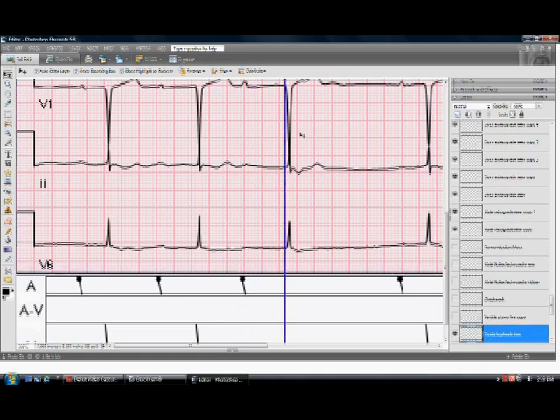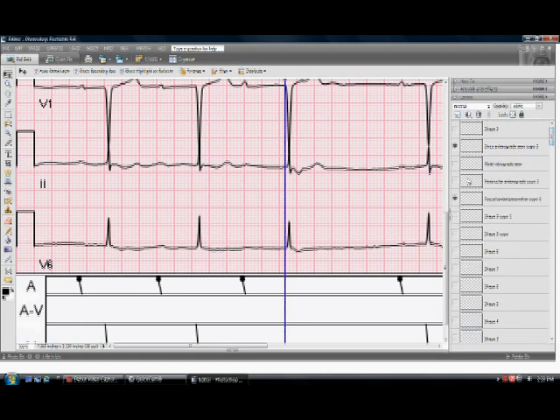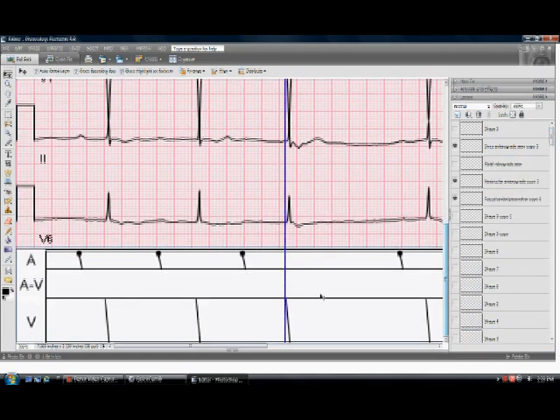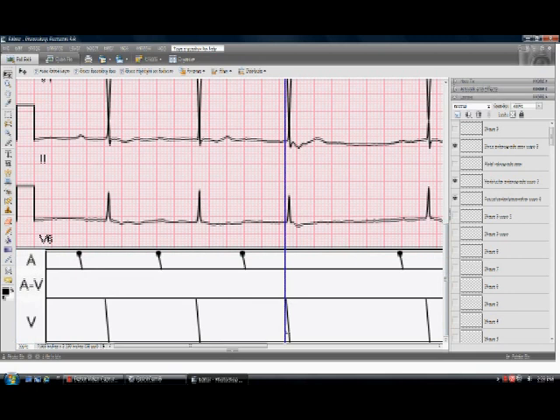Again, I'm lining it up with the beginning of the QRS in lead V1 and I would put mine down here in the ventricular tier. Again, another slightly oblique line lined up perfectly with that plumb line.